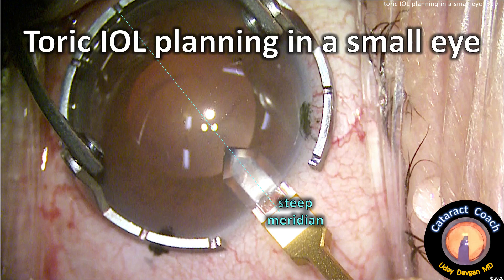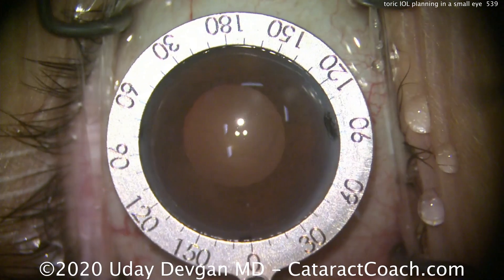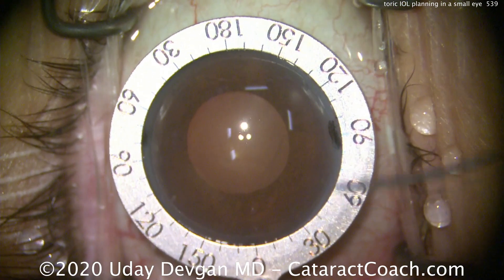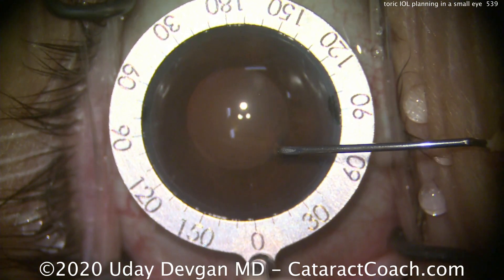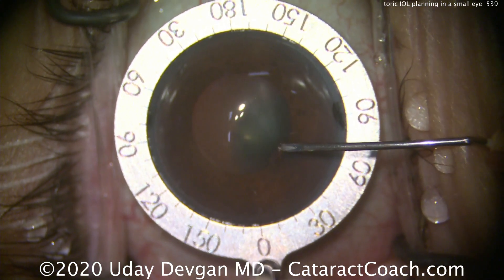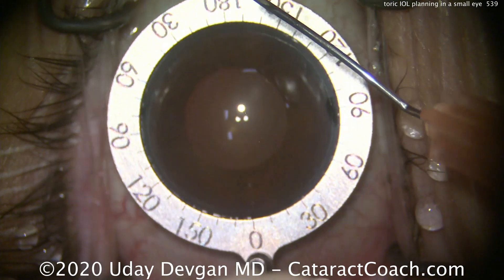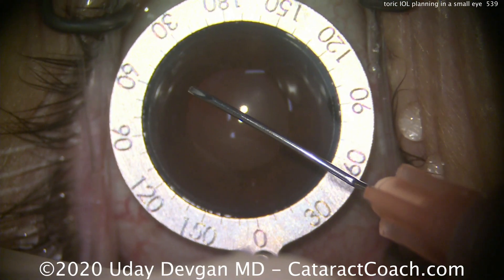Cataractcoach.com — toric IOL planning in a small eye. Let's go over some of these steps. First thing is marking our steep meridian; in this patient it's 50 degrees. The black ink marks on the cornea are the cardinal meridians of zero and 90, and then we're marking using a Mendez gauge approximately the 50 degree meridian.